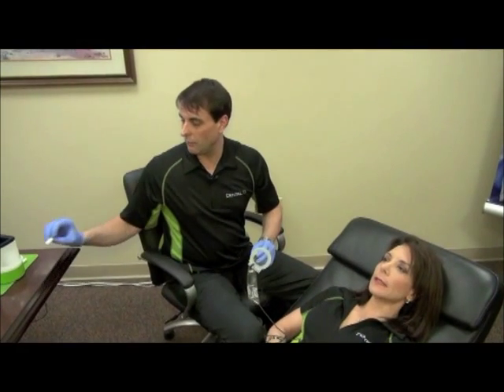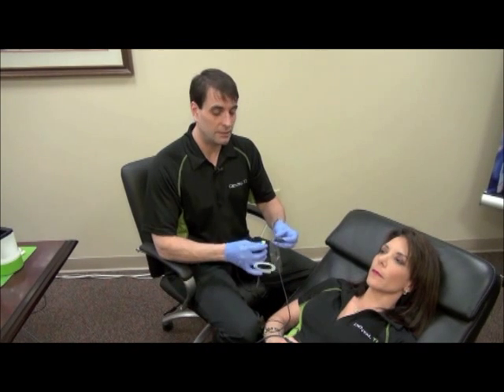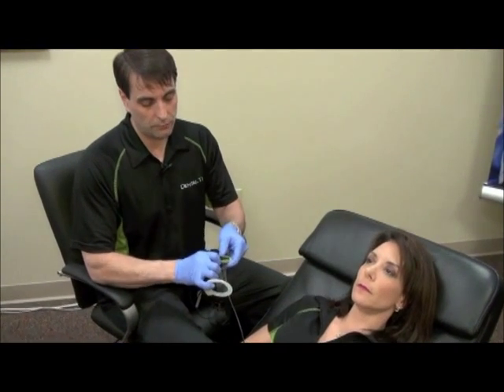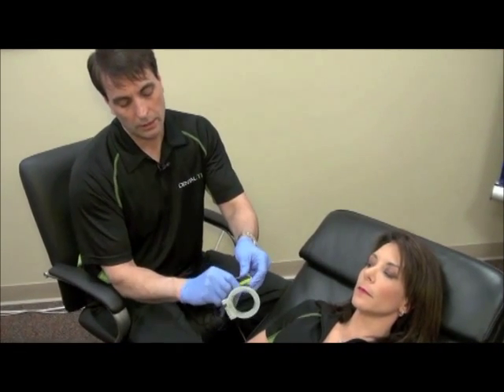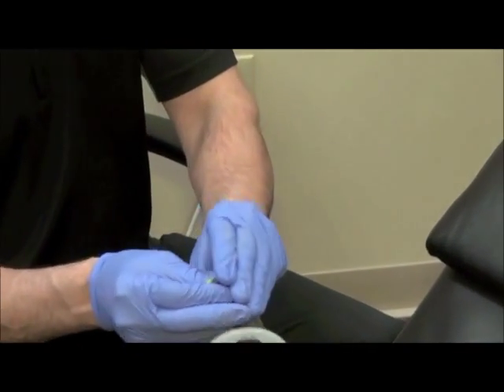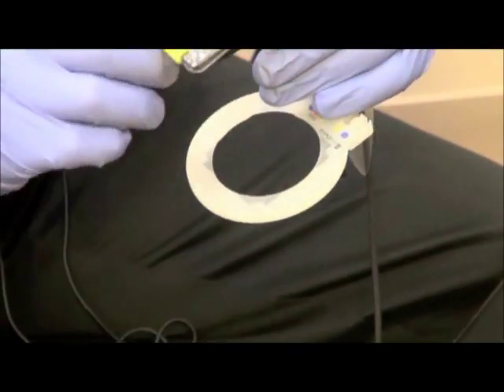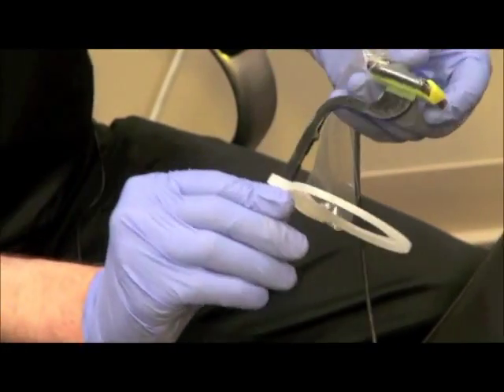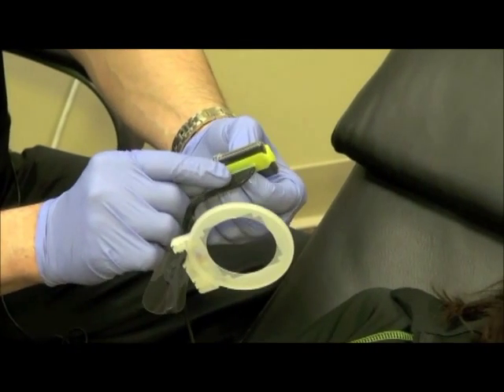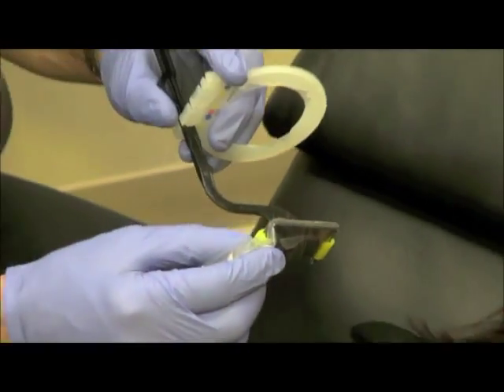Now let's move on to the bite wing holder. The yellow Trollbite can be used as a posterior holder and a bite wing holder. To use it as a bite wing holder, I recommend that you put it in and pull your finger here on the back of it to clip it around the sensor — you don't want to slide it in because you'll tear the plastic baggie. Now the holder has an alignment grid on it, and this grid is to aid you in opening contacts in the posterior area of the mouth when taking bite wings.